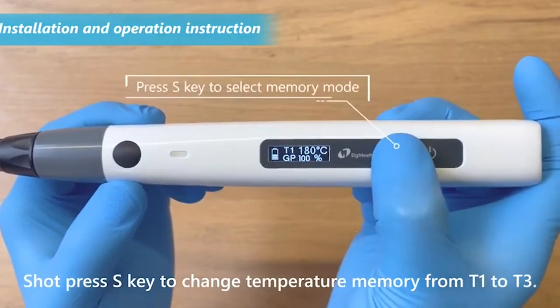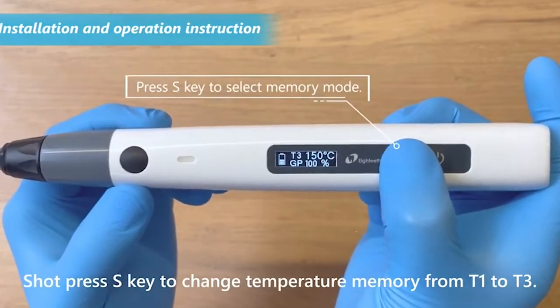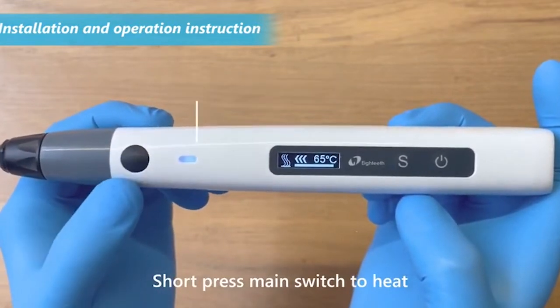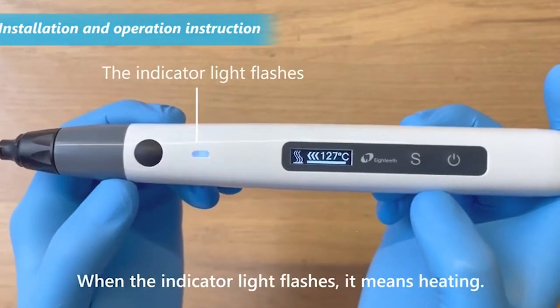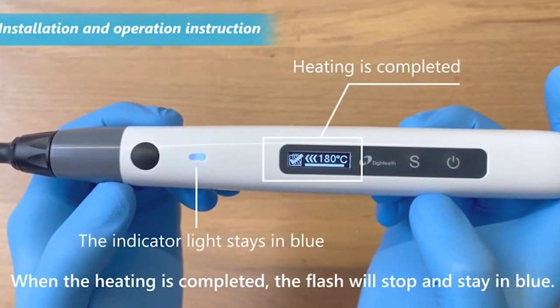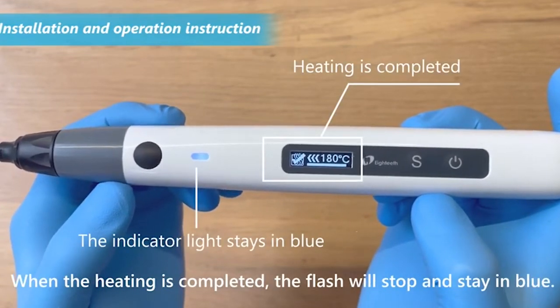Short press the S key to change the temperature memory from T1 to T3. Short press the main switch to heat. When the indicator light flashes, it means heating is in progress. When heating is completed, the flash will stop and stay in blue.